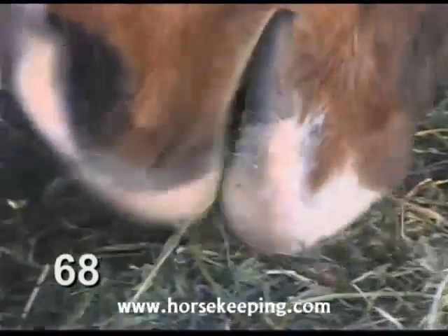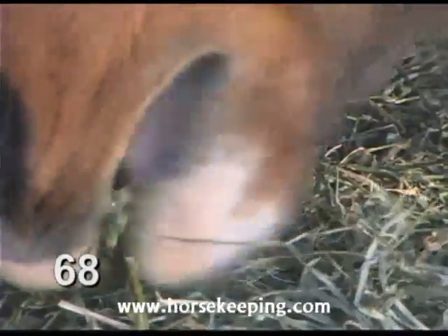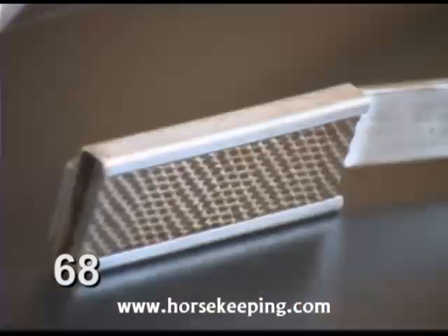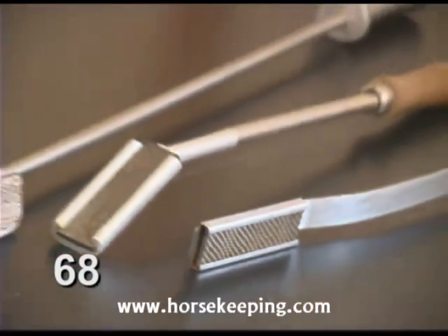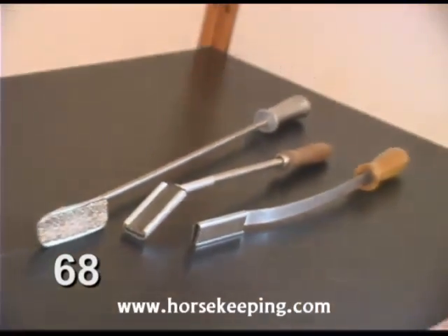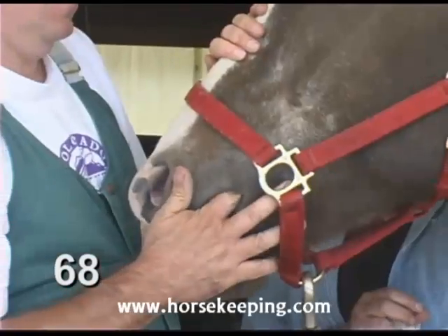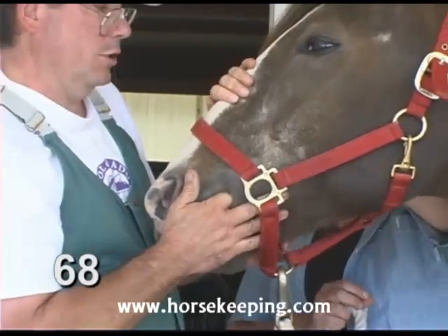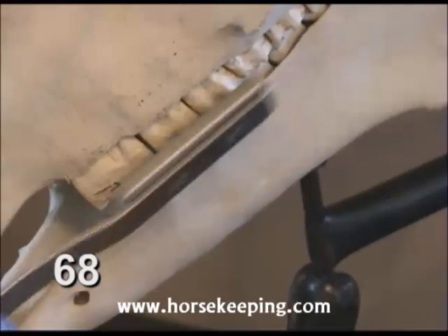To keep these sharp points from cutting your horse's tongue or cheeks as he eats, they should be filed regularly with a special file called a float that attaches to a long handle. Ask your veterinarian to inspect your horse's teeth annually and float them as needed.